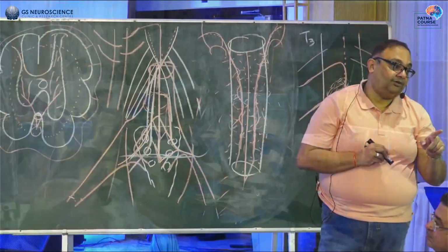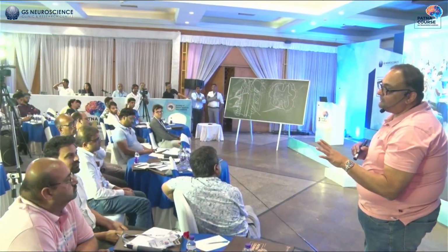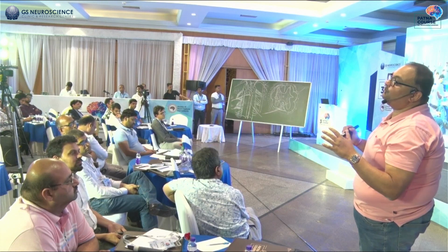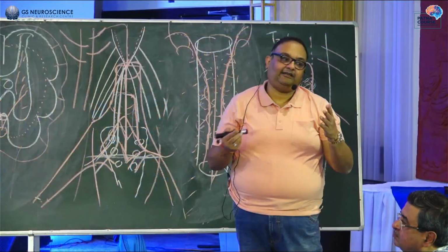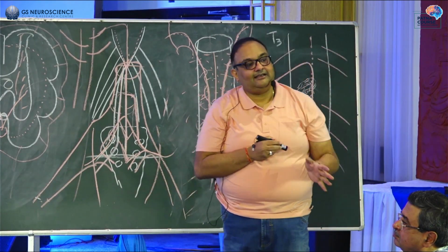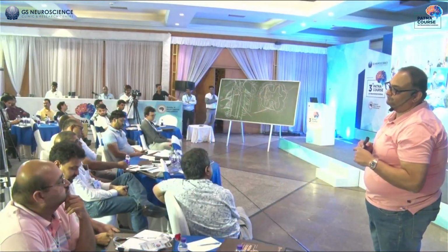Before embolization, you must be doing an entire spinal DSA in the same sitting. The advantage of that is, it is a single procedure, it is under GA, so your patient's gut has been prepared, so a lot of advantages. You have a jumping patient on the table for a spinal DSA, it's very painful, for the simple reason that after 10-15 minutes of lying still on his back supine without moving, the patient also starts becoming uncomfortable. Spinal DSA you cannot finish off in 10-15 minutes, unless you are very lucky, that is, straight away you went into the pedicle, one shot above, one shot below. That never happens. So that's why we localize based on MR, and then we go ahead for a single stage procedure. Contrast MR angio.